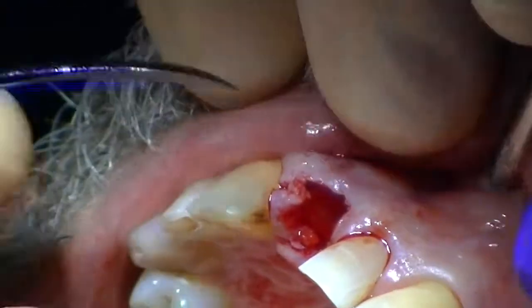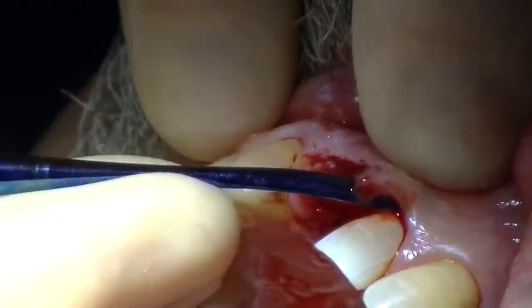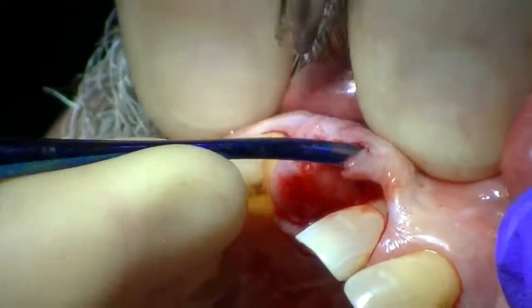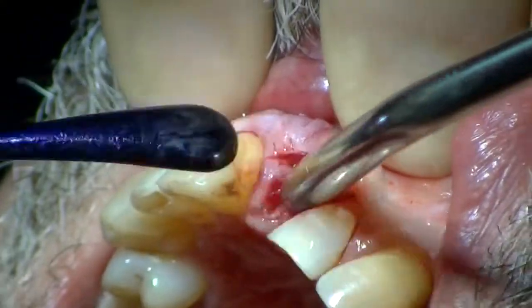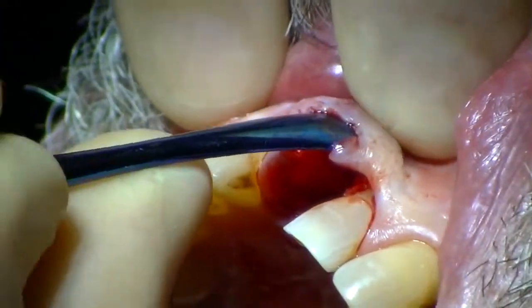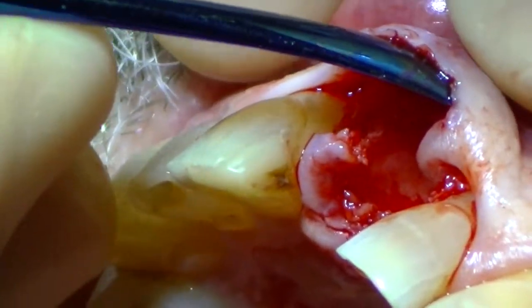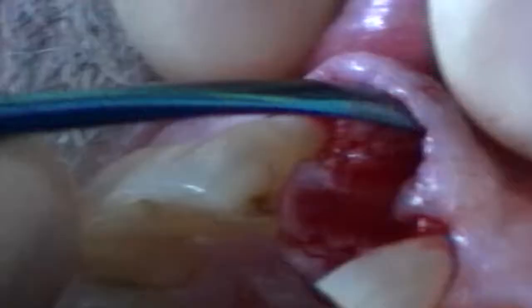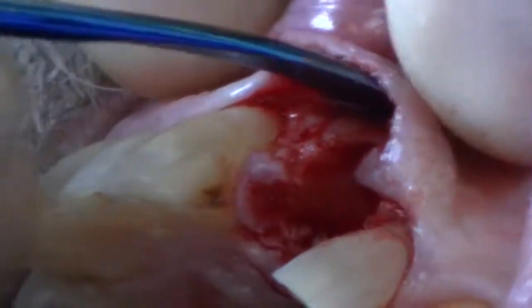And I'm going to reflect this for you with my envelope. You don't necessarily have to reflect it, but I just wanted to show everybody in the audience what we're able to accomplish. Be careful in there. Can you turn a little to me? So you can clearly see there's a facial plate of bone there. Can everybody see that all right?